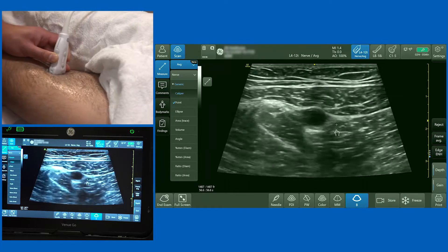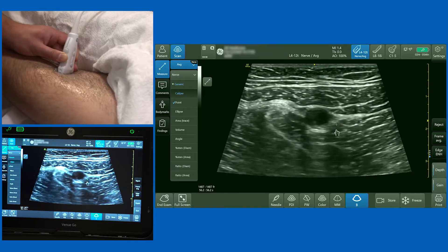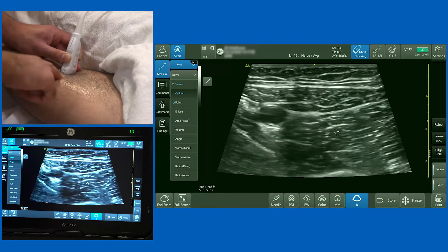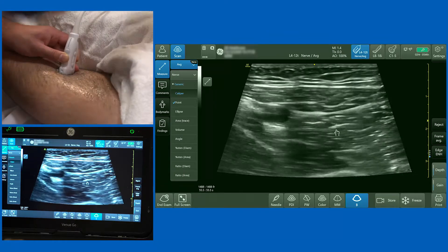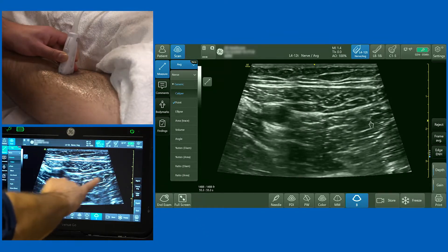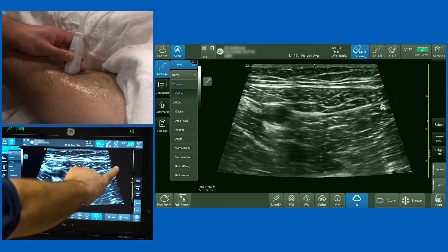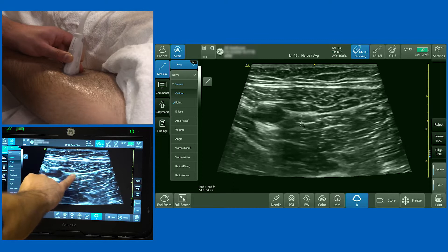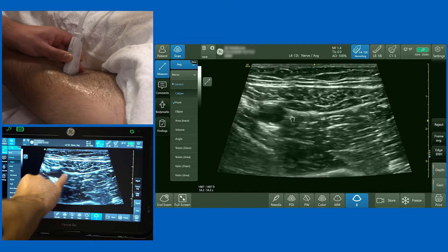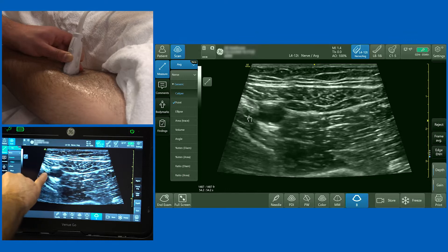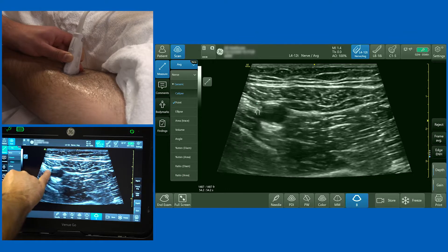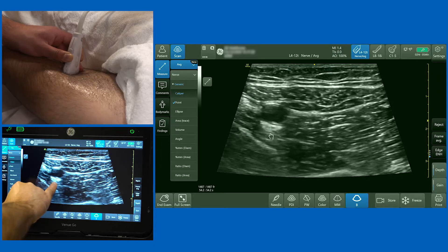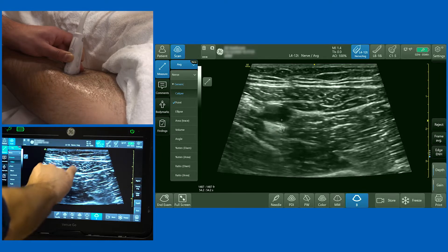Most people would inject somewhere between 10 to 15 millilitres of local anaesthetic around the superficial femoral artery, approaching from the lateral aspect either traversing through the vastus medialis muscle or coming down the groove between sartorius and vastus medialis and hydrodissecting as they go. The aim is to get local anaesthetic preferentially on the lateral aspect of the artery, but occasionally you can get your needle over the top of the artery and over the medial aspect as well. I wouldn't drive your needle down here because the superficial femoral vein is lying there.